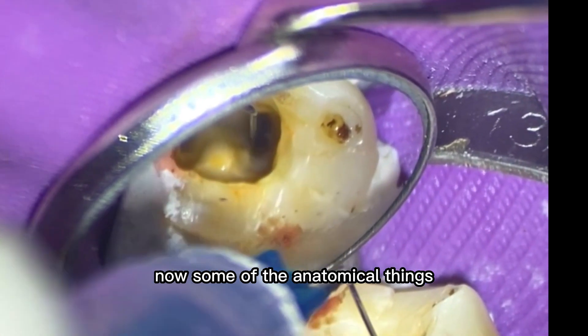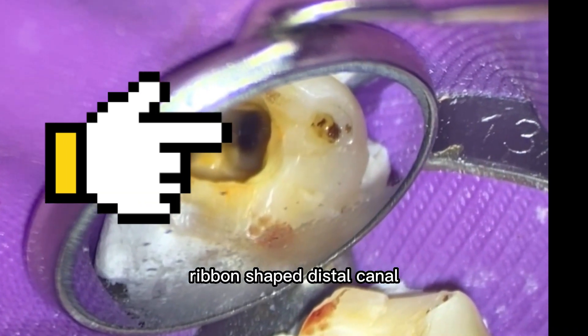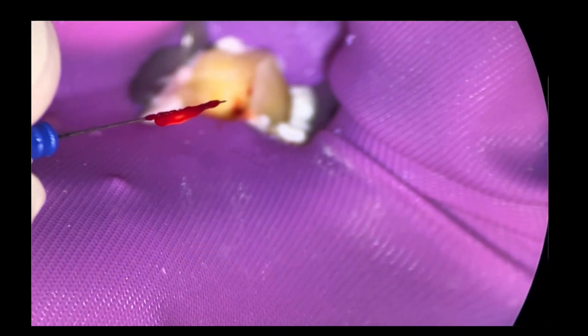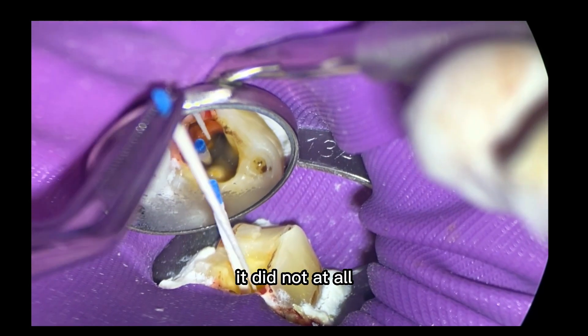Some of the anatomical things I'm looking at: it's a really wide ribbon-shaped distal canal. And when you see those in your mirror, you can expect there's going to be a lot of pulp tissue. Remember I'd shown you that I'd pulled the pulp out initially and I thought that gave me like a get-out-of-jail-free card — but apparently it didn't. Not at all.